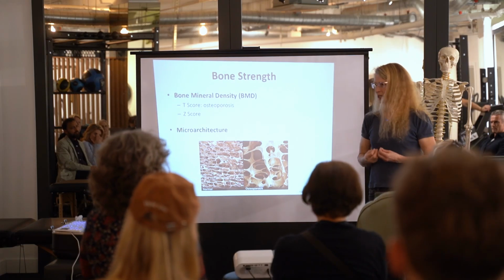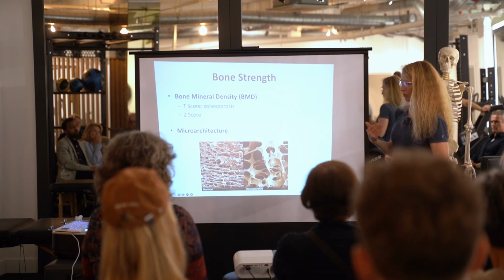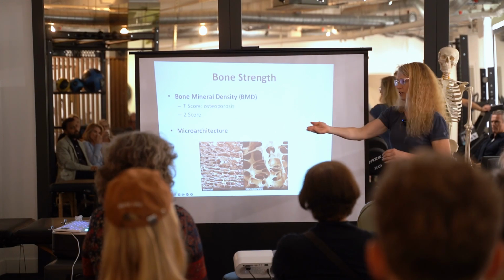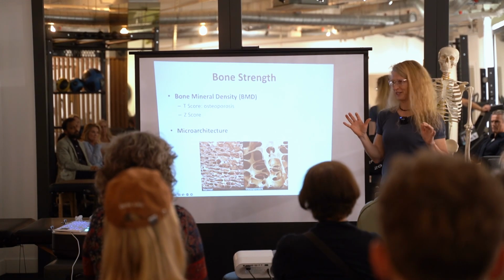So how are we going to assess your bones? Because they're deep inside you, not easy to access. So there is the DEXA scan that we mentioned, which stands for dual X-ray absorptiometry, some X-rays involved. And then there's the REMS, which uses a special form of ultrasound. I'm definitely not going to go into the physics.